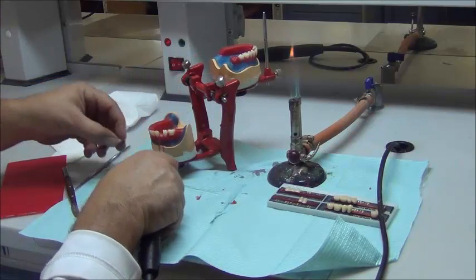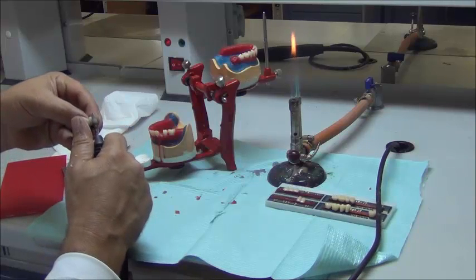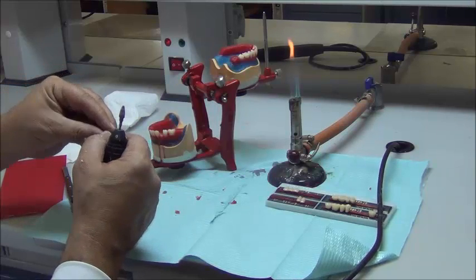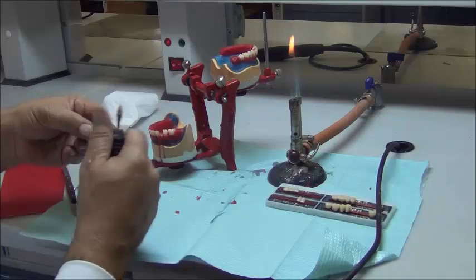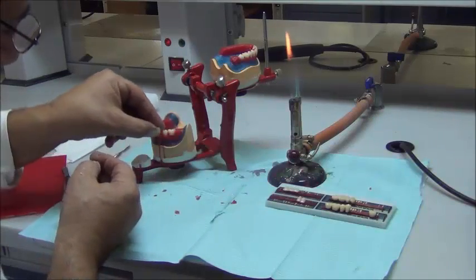Remember that when you remove, the surface will be very straight, so make a roundation. So go slightly to the labial and slightly to the lingual to reduce the straight shapes and return back the tooth with curves. So it's not a straight cut onto the tooth surface. So go back and make it round. And then we try to fit it in place.